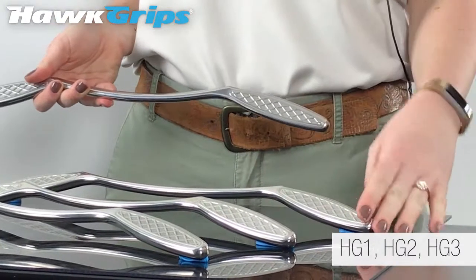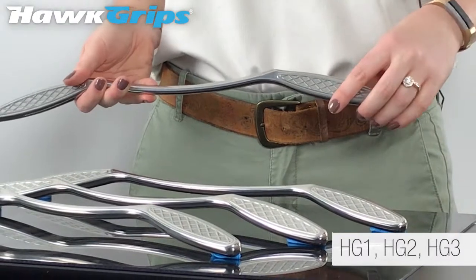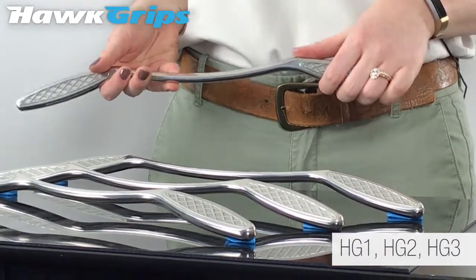Hawkgrips has three different size handlebars, with the middle size definitely being our favorite and featured in our gold set. All three handlebars come in our platinum set.